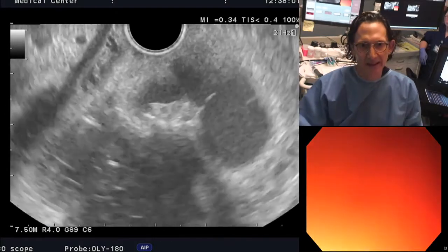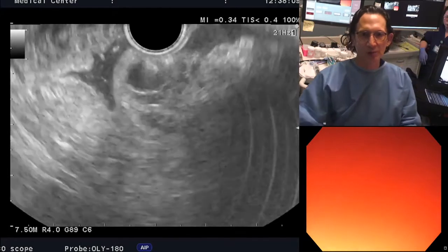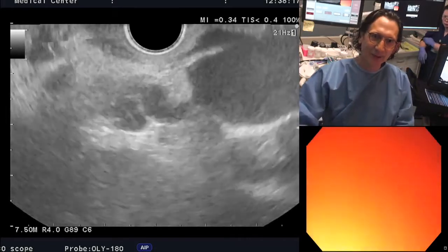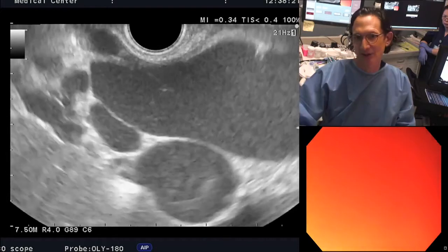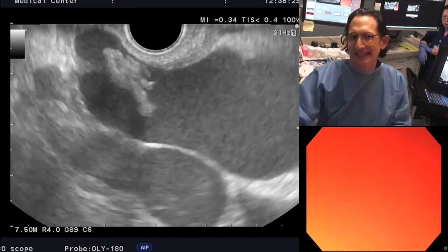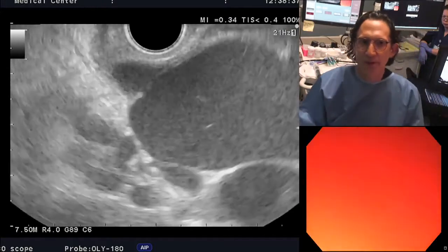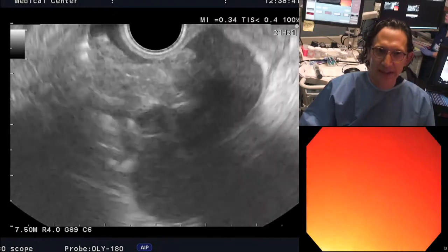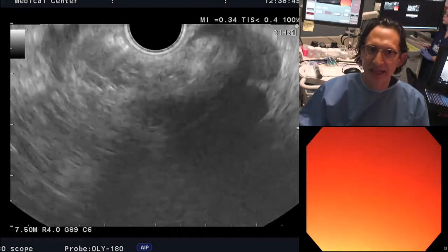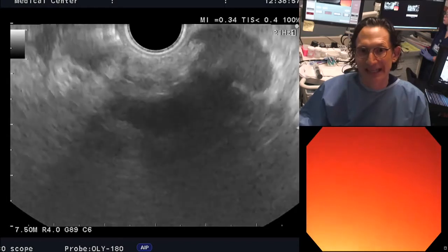Remember, we only want to get the varices that are intramural. You see the coils here inside. This is where previously you saw those big lakes. There are no big lakes anymore. This is the intramural. Now these ones, well, they're still there. We want to stay away from this. And look, there's a little bit of something fluttering there. You see, that's how easily it's just hanging there, hanging on the coil. So you have to have a lot of respect for what can happen when you inject glue into a vascular system where there's vigorous flow, as there is in these varices, and when they're so large. It's sort of like injecting into the IVC when they get this big.